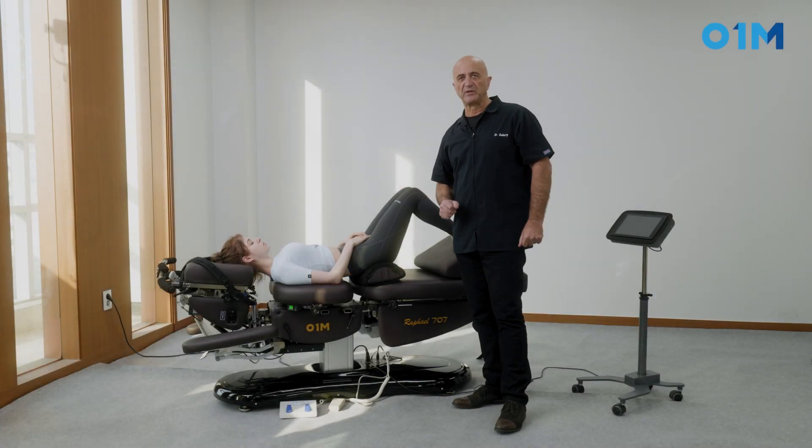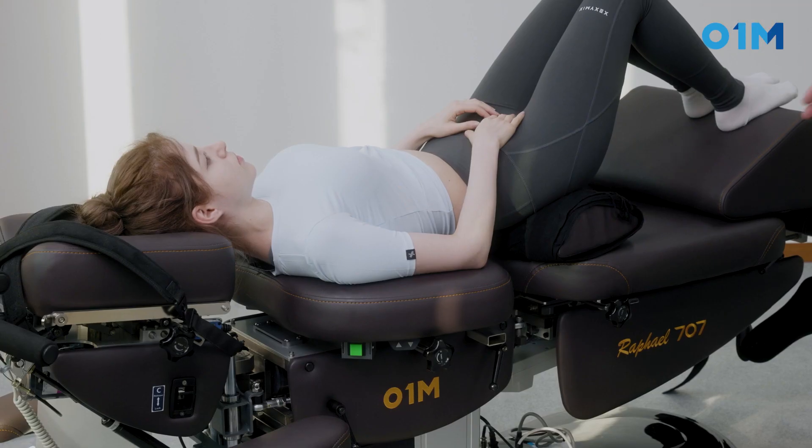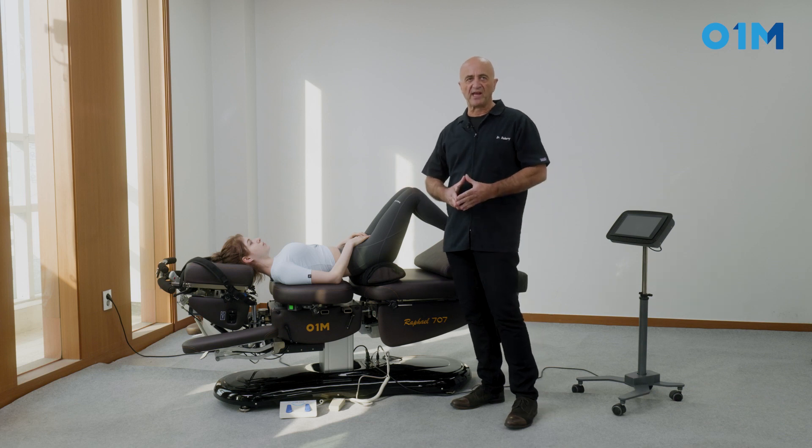The treatment of an enterospondylolisthesis on a segmental table like this one. Great treatment, works very well.